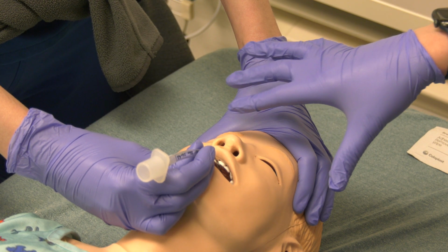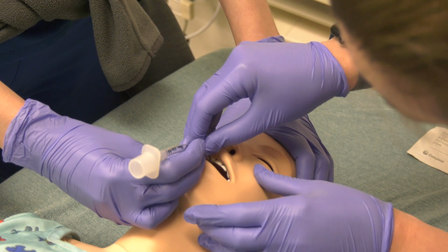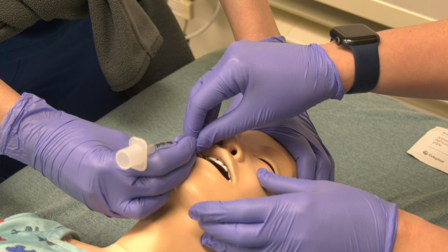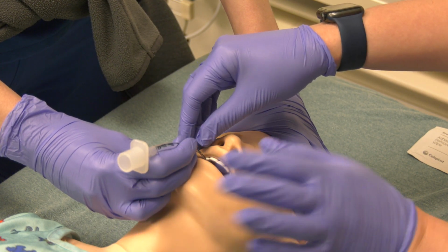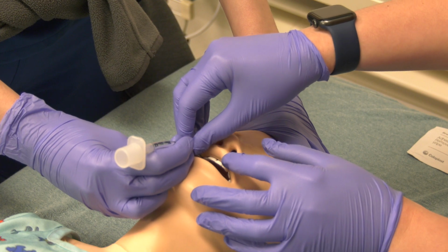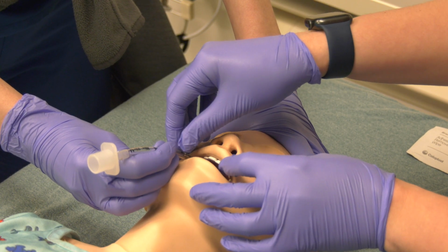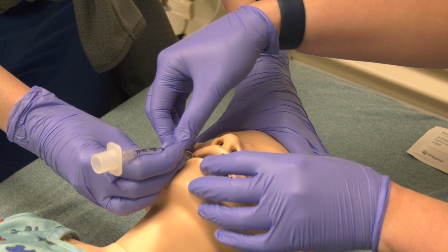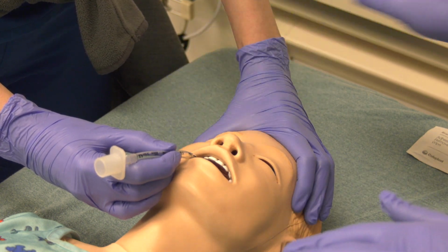And before removing the tube, it looks like it is at 14 at the teeth. And I'm just going to go ahead, our cuff is inflated, the patient's properly paralyzed and sedated. I'm going to go ahead and move the tube to this side of the mouth, the right side. And just make sure that it's not completely to the side, just to avoid pressure ulcers.